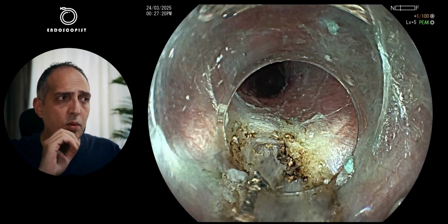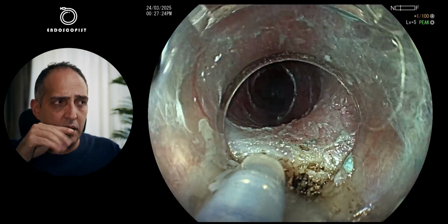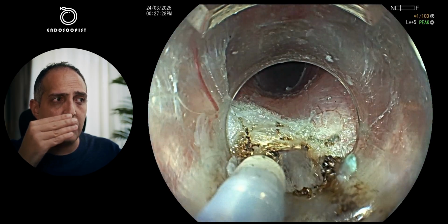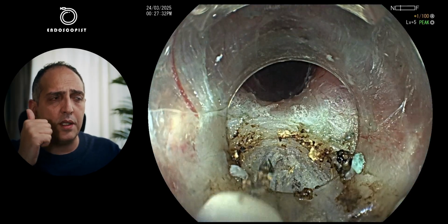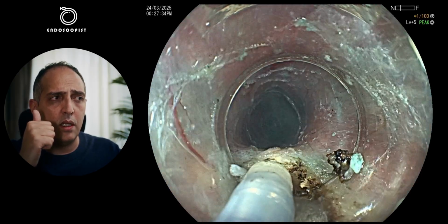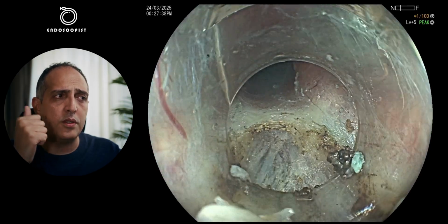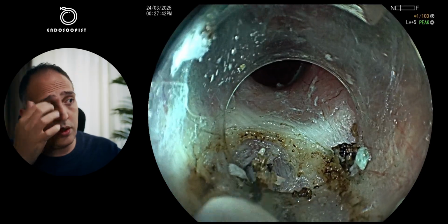I will push my scope. I will anchor with the tip of my knife in the layer of the circular muscle, and with very gentle spray coagulation I will cut it. As you can see here, I only used cut mode during the mucosal cut, and then I continued the whole process, either the tunneling or the myotomy, with the spray coagulation.